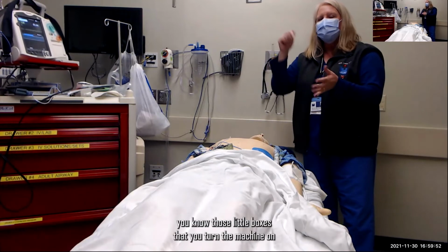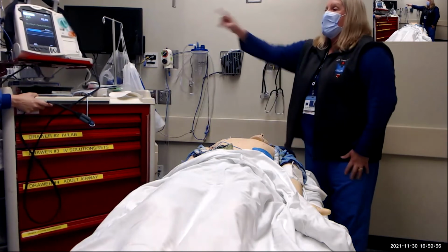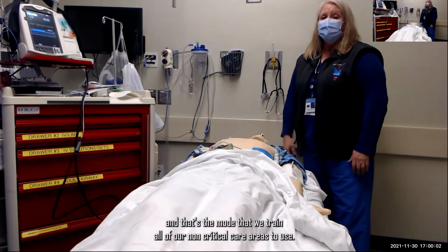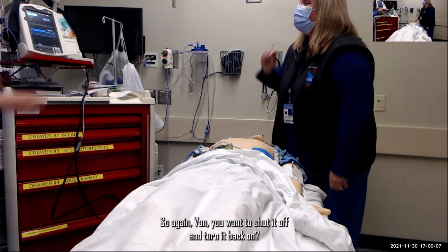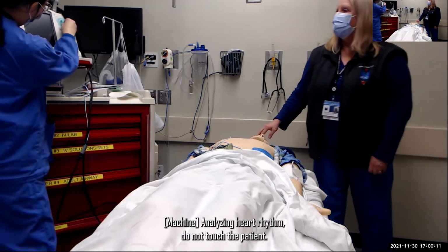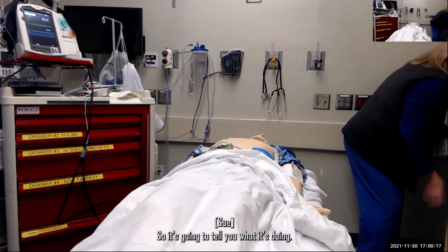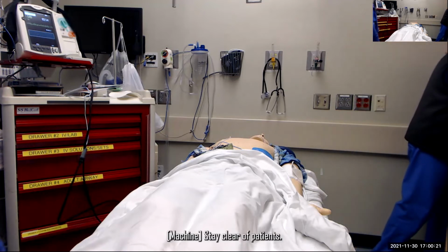Okay. So you may have noticed, if you've taken a CPR class before, you know those little boxes that you turn the machine on and the voices talk to you and tell you what to do? Our machines have a built-in AED, and that's the mode that we train all of our non-critical care areas to use. So again, Van, you want to shut it off and turn it back on? Okay. Analyzing heart rhythm. Do not touch the patient. Shock advised. Stay clear of patient.